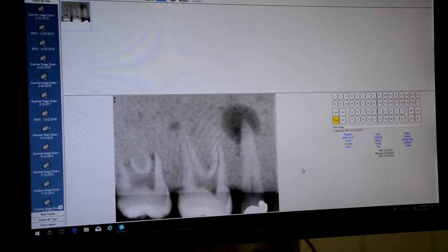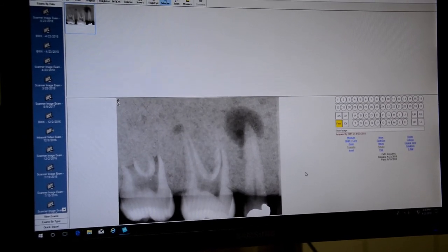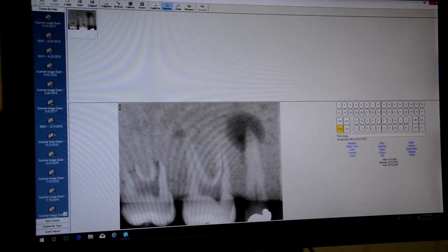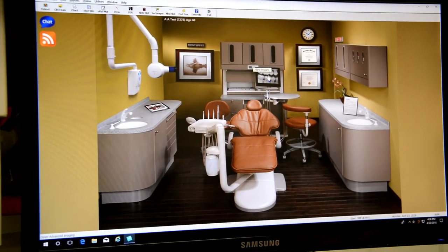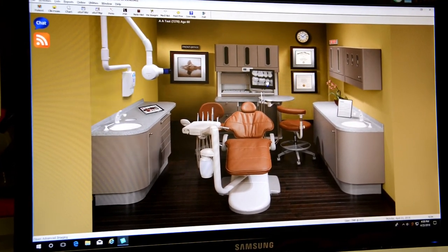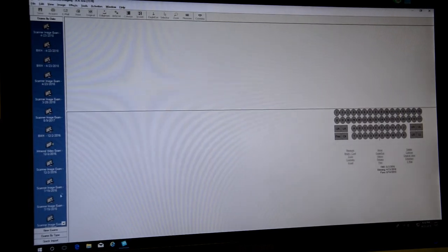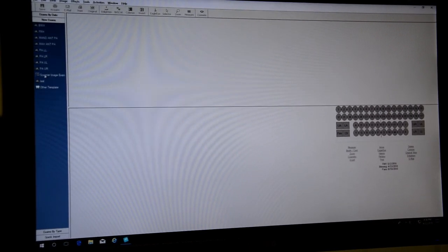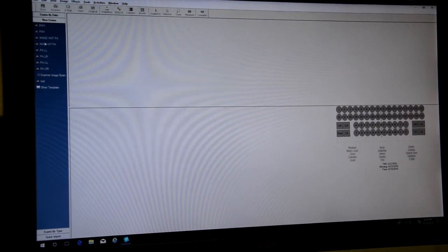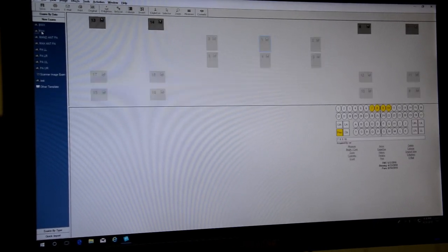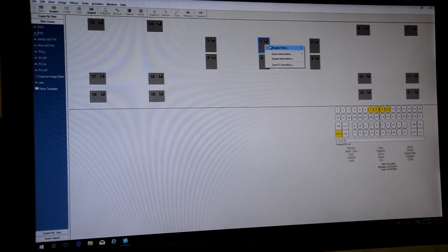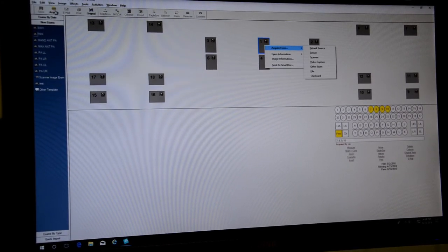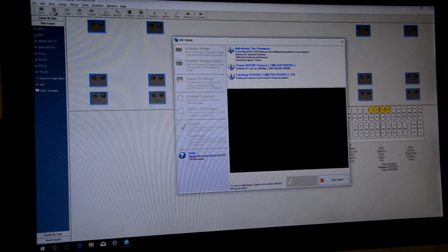If you wanted to go straight into one of the formats. How would you do that? Okay. So if we close this out. If we wanted to go right into one of the formats we'll click on the x-ray screen here. From here it's going to come up. We can select our new exam. So if we wanted to do for example if we wanted to start our FMX. We click FMX and right click to acquire from or click the acquire button on the toolbar.